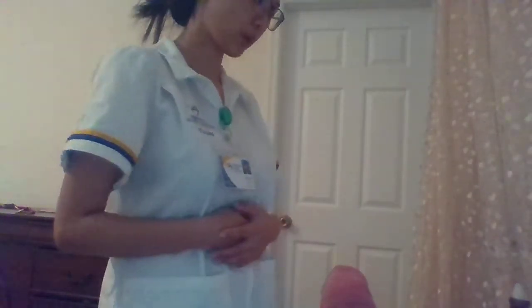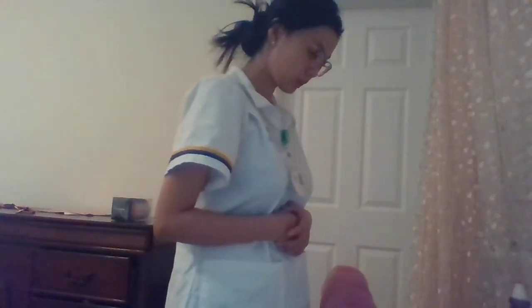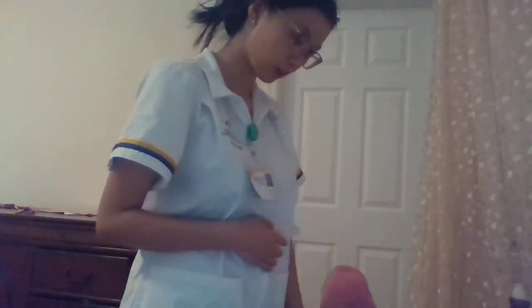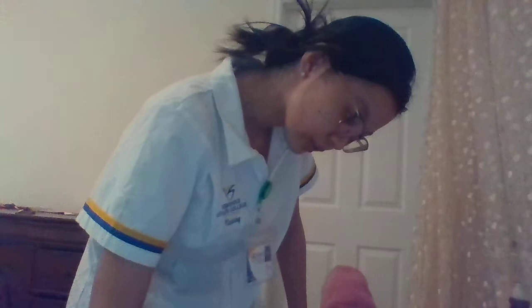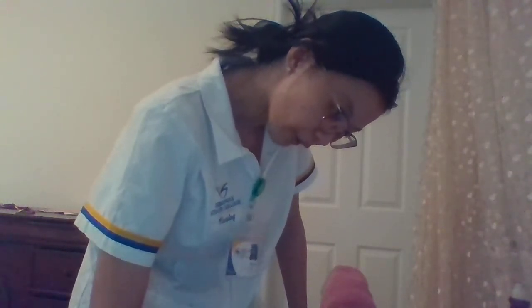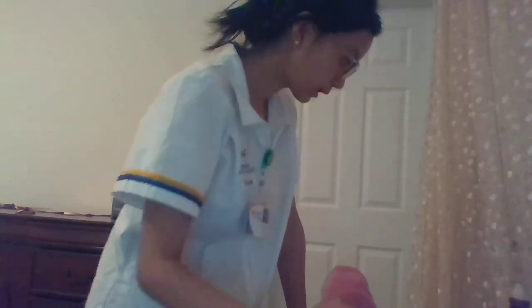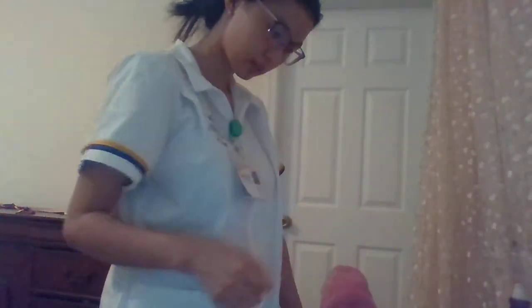This is for my intramuscular checkoff. Before I enter the patient room, I should check the healthcare provider order and the patient's allergies. So the order is intramuscular influenza vaccine, and the dose is 0.5 intramuscular, and the patient is Anna Pulaski, and it says she's allergic to penicillin.